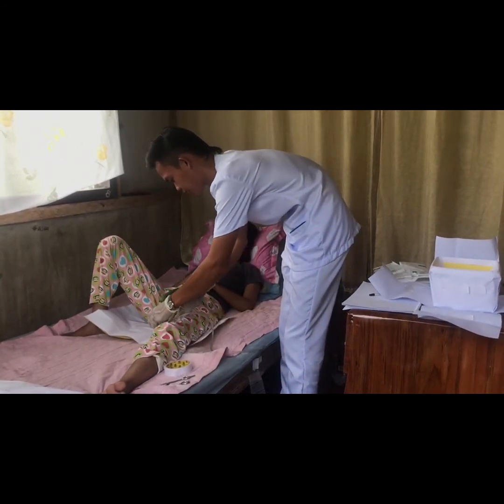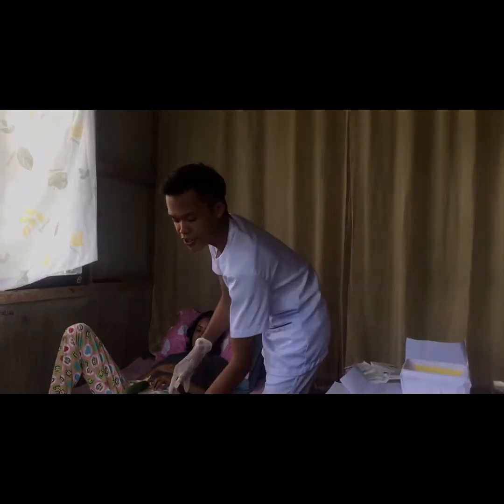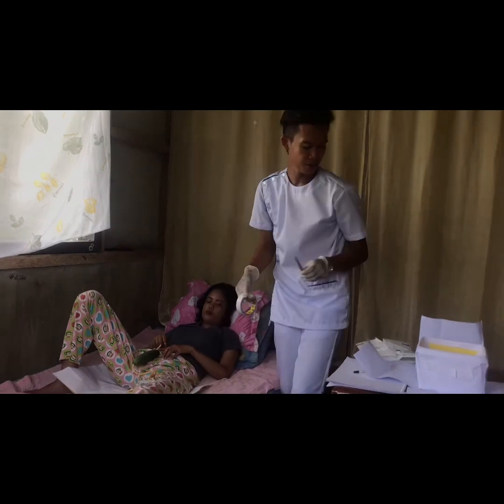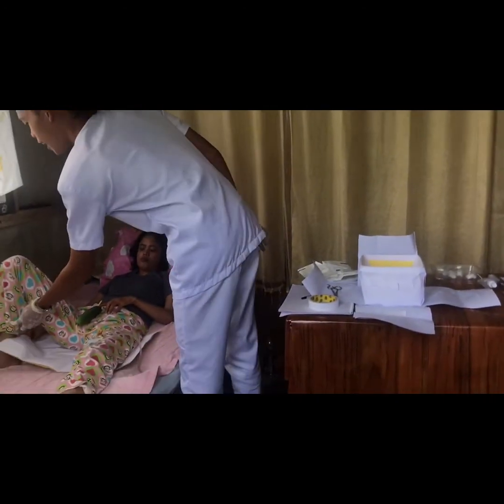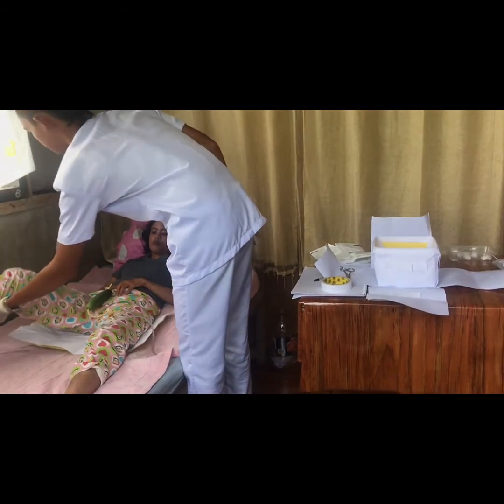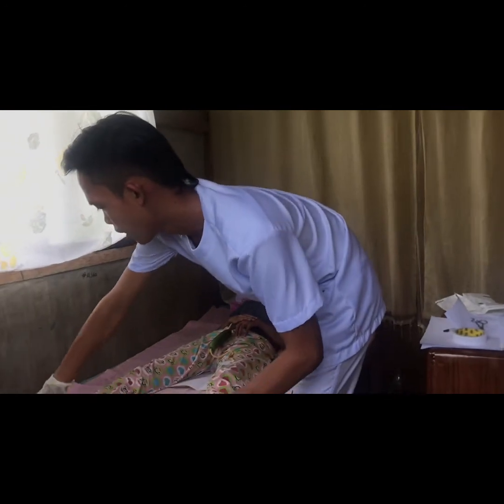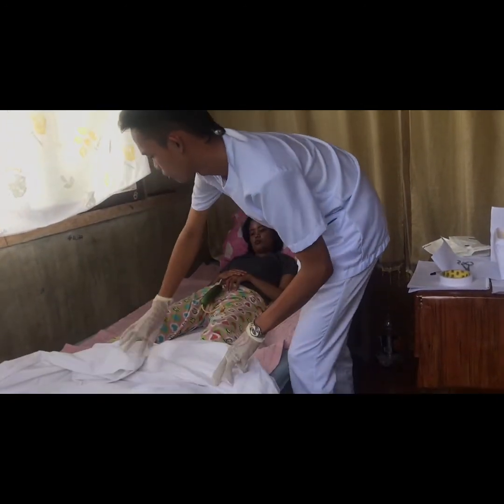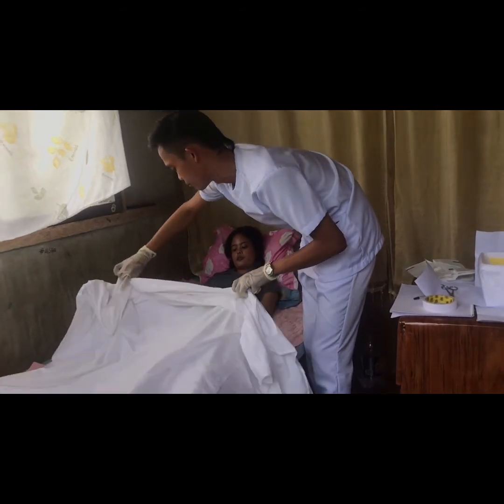Yes, I'm fine. Okay. So after we attach the stat-lock stabilizer, we're going to have this equipment placed here. Please have it made straight. Okay, and I'm going to roll it up in order to make it. Is it okay? Yes. Okay.